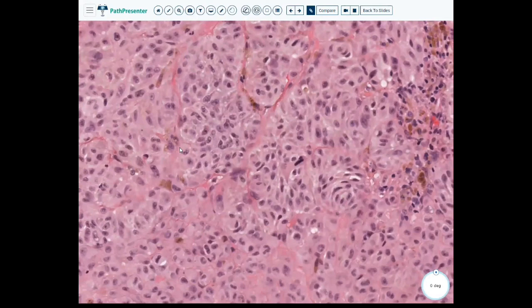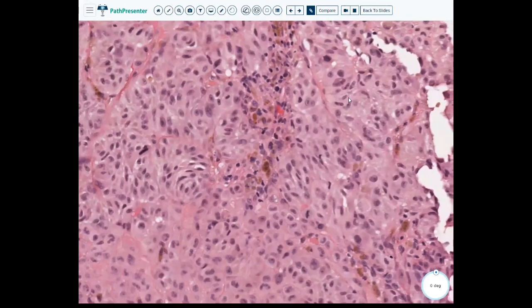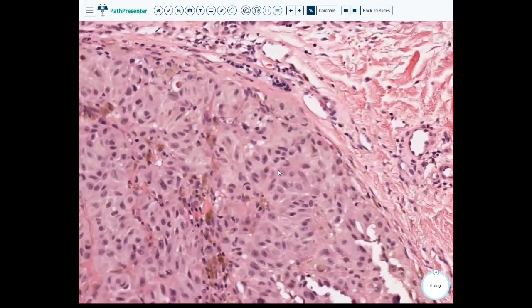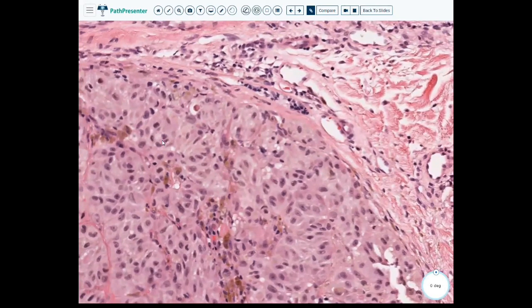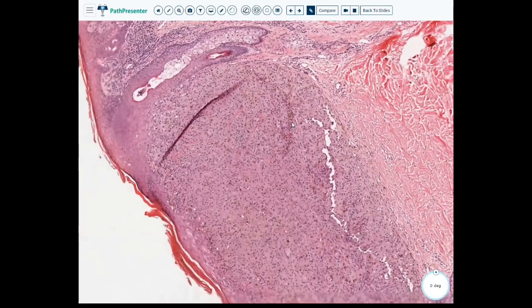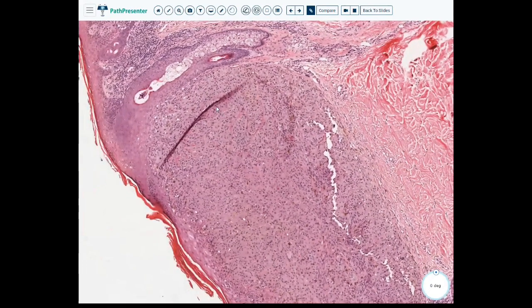There's another one, and they are slightly red. There is this somewhat clearing of the chromatin, which again we see all the time in our melanocytes. And there aren't really well-defined cell borders. Okay, so well-defined cell borders would clue us in more towards our squamous epithelium.